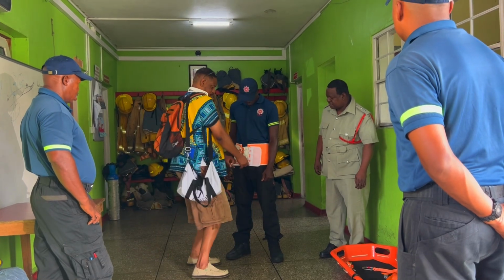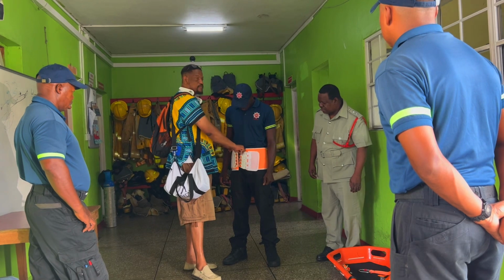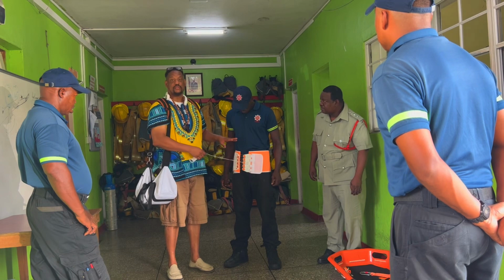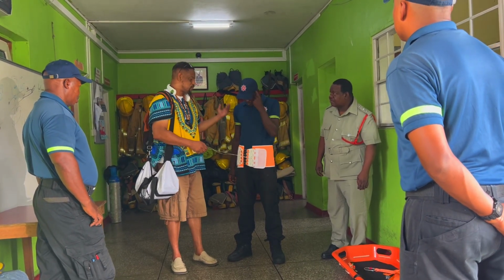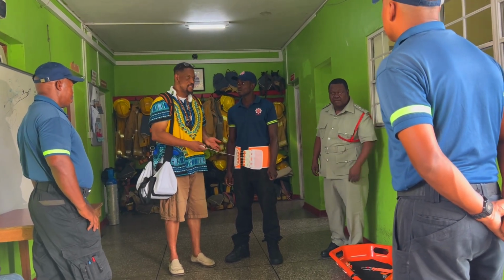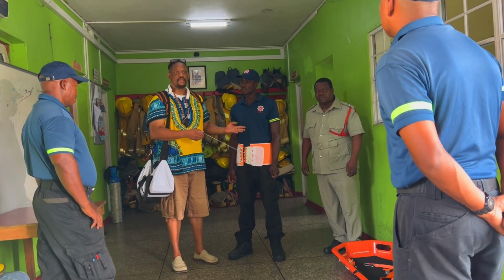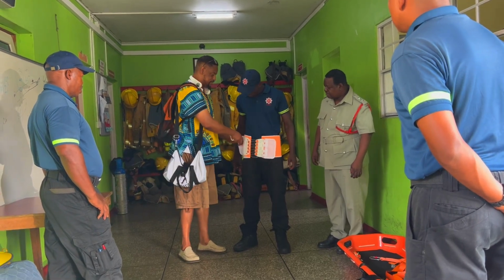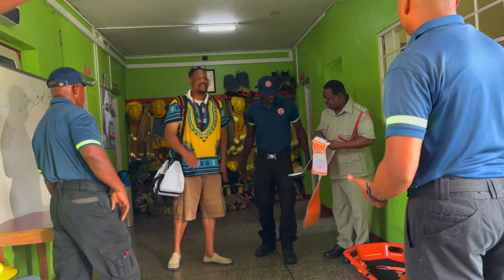So again, you just do the reverse, take it off and release it. And sometimes you can release it and just leave it on the patient. Again, you guys don't have this in the field, but you have so many of these back home. You just leave it on the patient in the hospital for 24 hours like this. If the pressure drops, you pull it back up again. Things like that. So, very, very simple device, guys. And again, there you go. It's not that difficult.